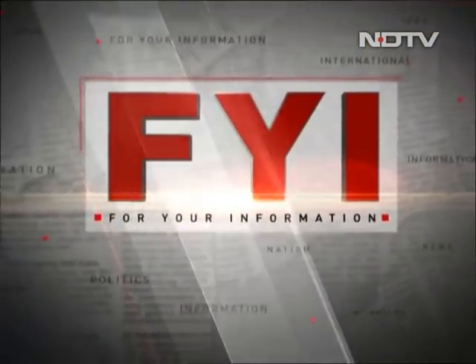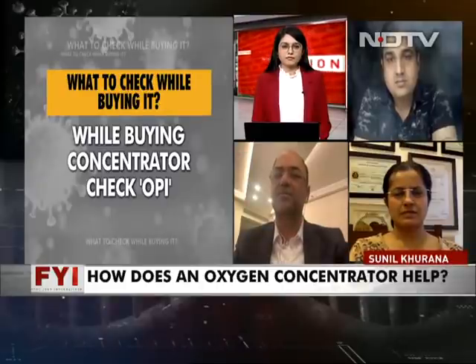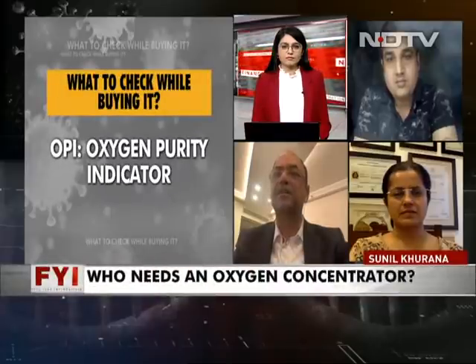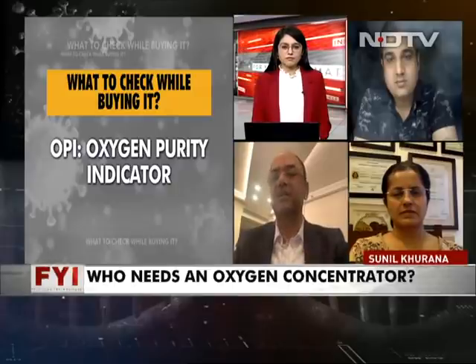And as Dr. Gupta said, this is fuel for the body. So it is so important that you get the right product. With your overall judgment, seeing the fit and finish of the machine, you will understand which is not made in good quality, that you can probably judge. But best is to go to the sites of these couple of companies which are proper branded companies, or connect with their distributors who are recognized distributors. Like if you're buying from a BPL distributor, you are very assured that he's giving you a BPL product. Or if you're buying from Philips, you know that it is coming from them. So that's the advice I give.